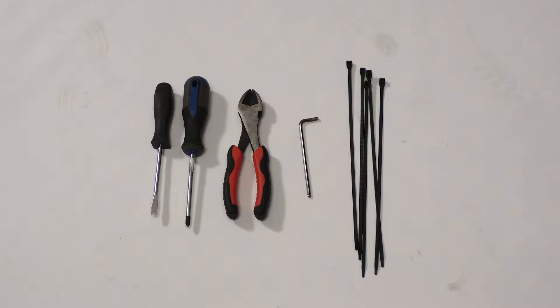Tools needed are a straight slot screwdriver, a number two Phillips screwdriver, a pair of cutters, an M4 Allen wrench, and some zip ties.